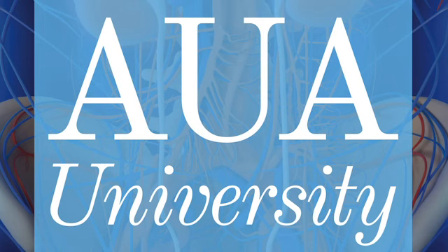The floppy tip is thought to reflect back out the urethra when it encounters a false passage. As of 2010, this method was the second-line attempt in approximately 15 to 20% of U.S. residents in a survey study. Risks of blind wire passage include passage of a wire into an existing or new false passage with subsequent dilation of a false passage with associated urethral trauma. In cases where blind wire passage is not possible, these attempts can unnecessarily prolong the procedure and increase patient discomfort. To confirm intravesical passage of the wire into the bladder prior to catheter advancement, a 5 French open ureteral catheter can be placed over the wire to confirm lack of resistance.